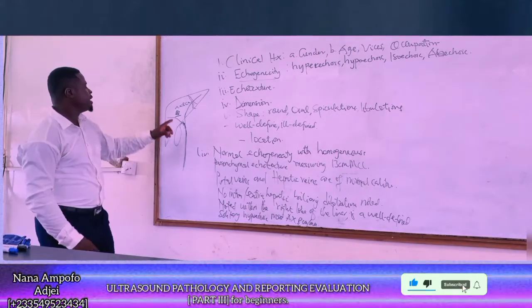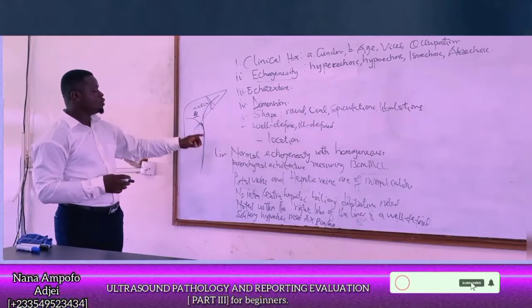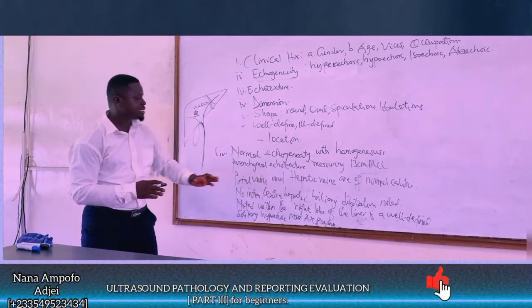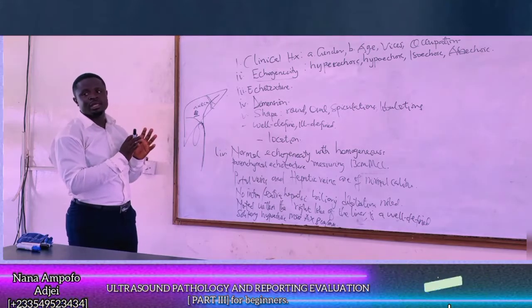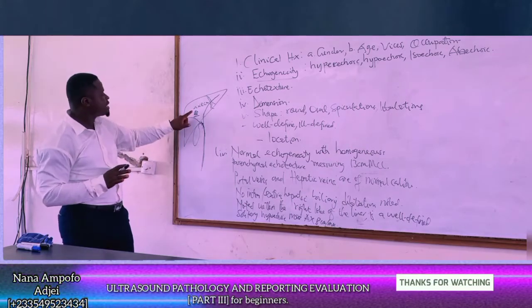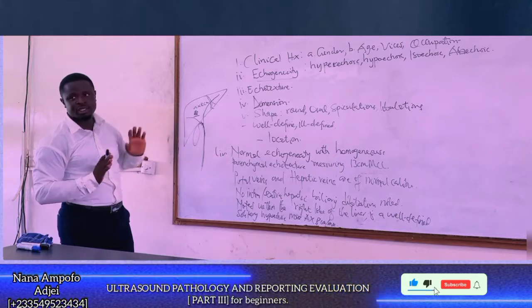If it is hyperechoic, we also change it. So you stated that there's a mass within, but you made it clear to us that the hepatic ducts are normal, because sometimes there may be a mass within the liver that may cause obstruction of the biliary system, and then the intrahepatic ducts may become dilated. By this time, the lesion is there, but it's not causing any dilatation of these ones. So we're reporting your report here.